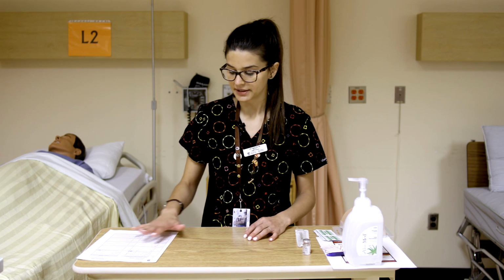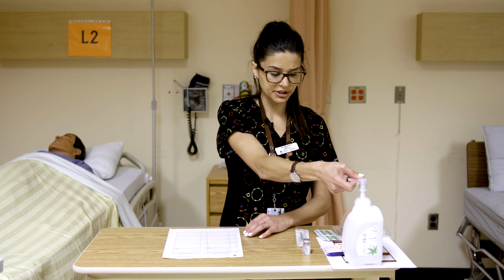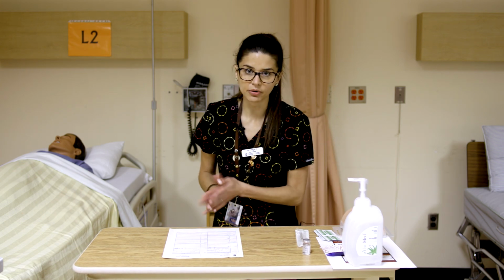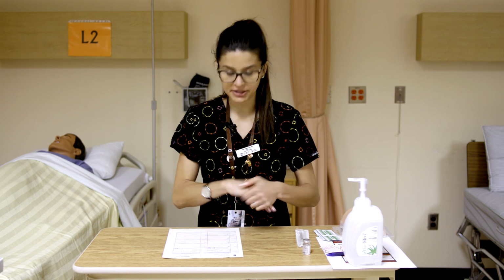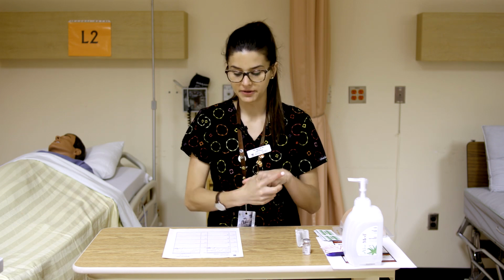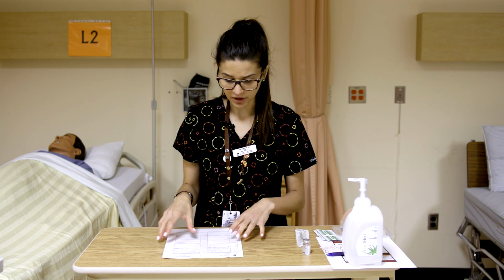and the type of supplies that you'll select. So we'll always start by washing our hands and then obtaining the order and the MAR for our patient, and doing our checks with that, as you guys know. So we're going to be checking our 5 rights 3 times throughout.